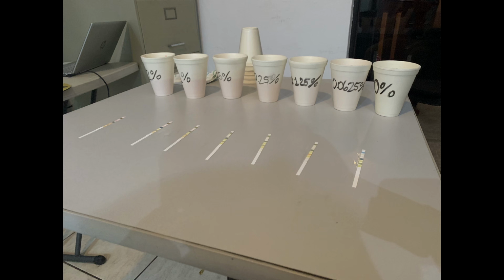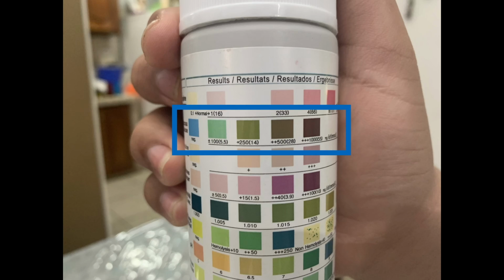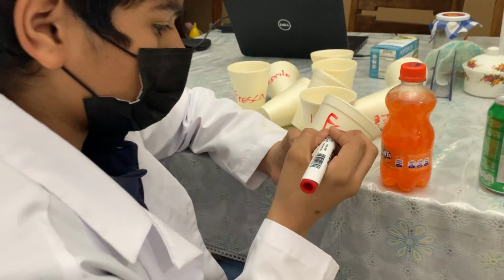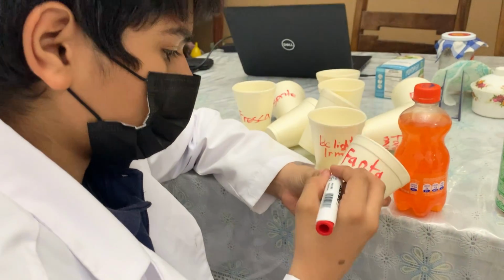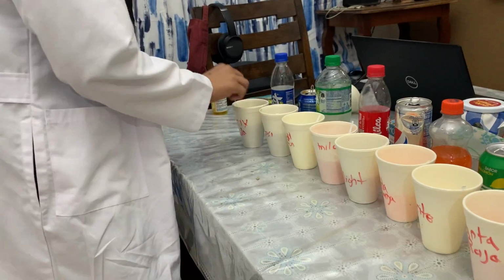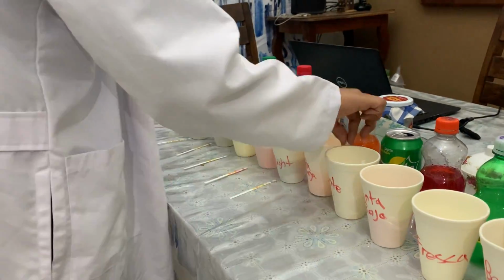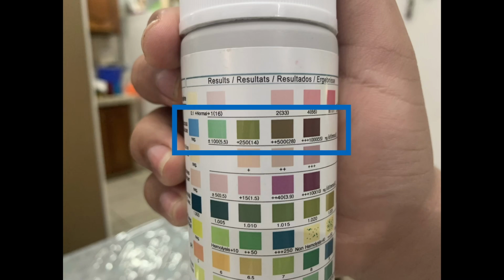After we see that the urinalysis test strips actually work, we will start measuring the glucose amount in our fruits, vegetables, soft drinks, and sauces. Now for any liquid or viscous substance, we must first pour it in a small cup. Then we will dip the test strips, and after removing them for 1 to 2 seconds and waiting 30 seconds for them to show the proper color, we will match this set color to the colors on the bottle to identify the glucose amount in the substance.